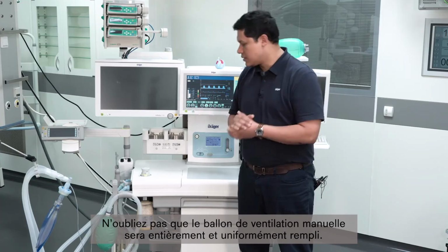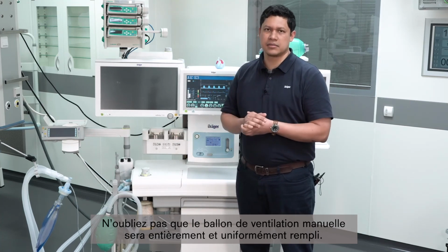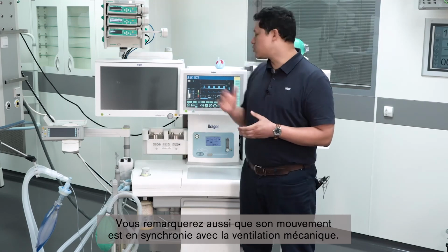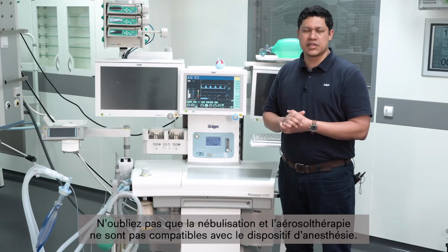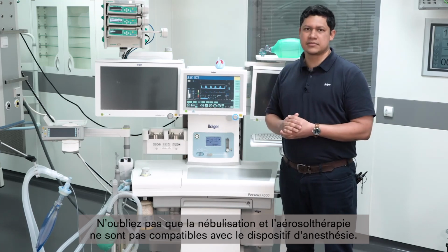Keep in mind that the manual breathing bag will be fully and evenly filled. You will also notice that it will move in synchronization to the mechanical ventilation. Remember that drug nebulization and aerosol therapy are not suitable for the anesthesia device.